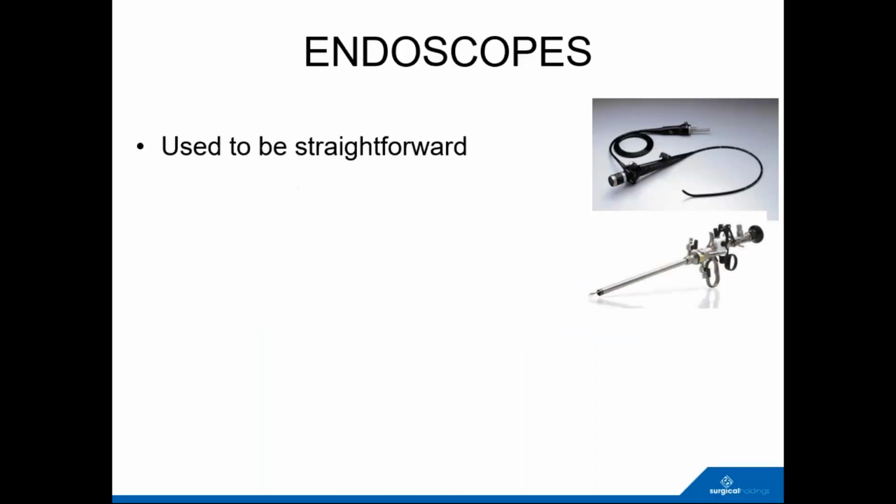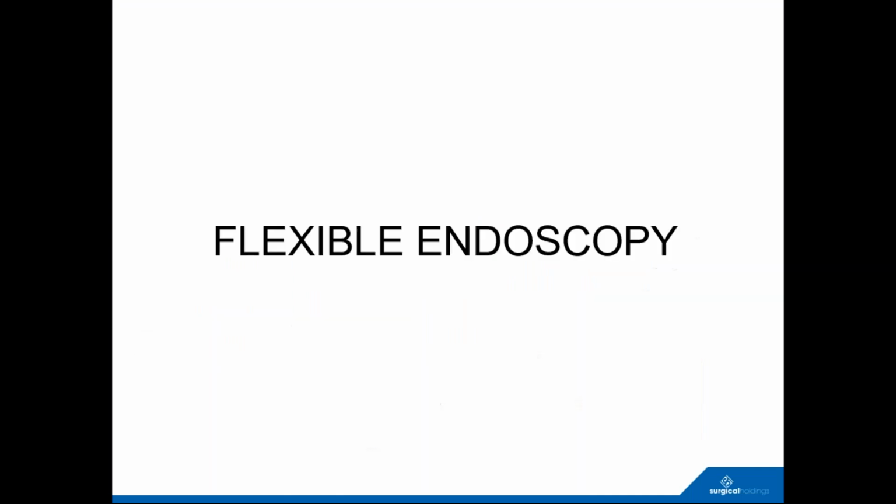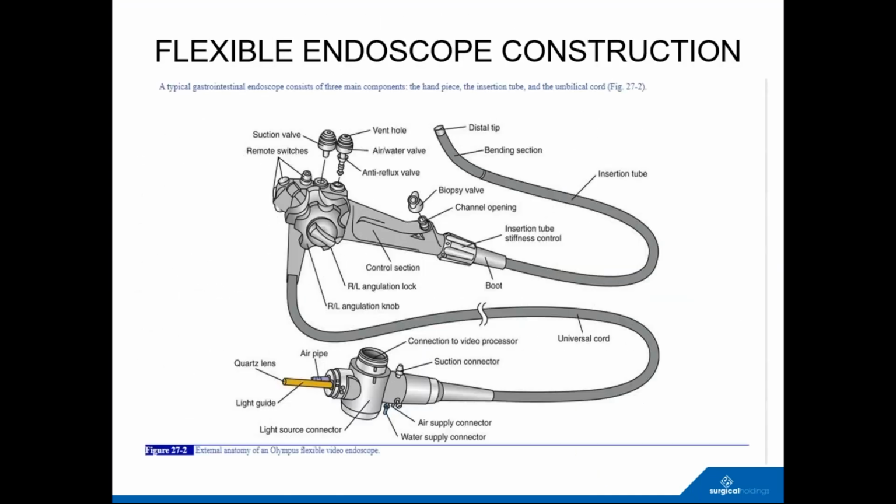Great. Claire has a follow-up question: what's the main way that fluid ingress can happen? One of the classic situations, depending on the type of instrument you have, is leaving a cap off. This is the connection to the video processor, and there is usually a cap for that with most instruments, older ones certainly, though some newer ones don't need it.